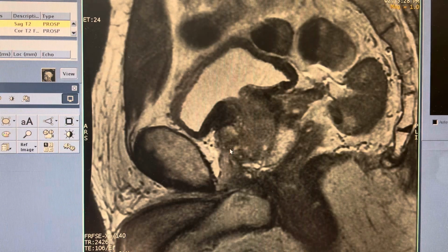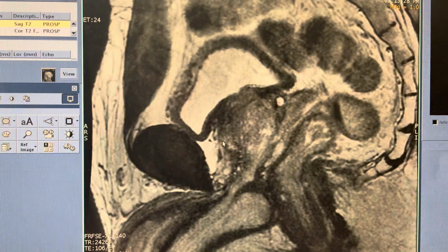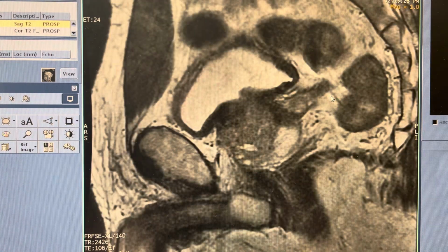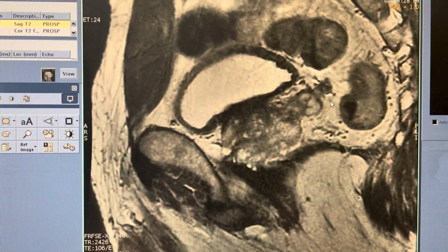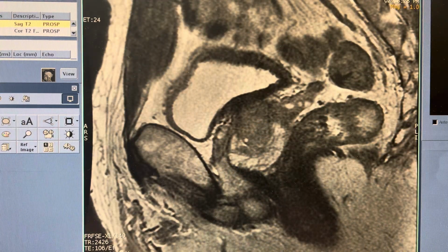You want to cover in front of the prostate. I typically provide a couple extra slices just in case, and then a couple extra slices behind the distal aspect of the seminal vesicles, or posterior aspect of the seminal vesicles. Sorry, my cross-reference is only there for the one slice. But yeah. Put it down here again.